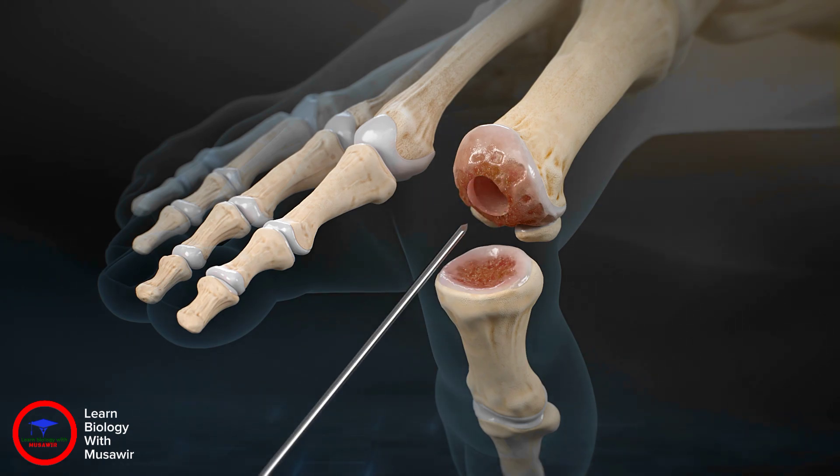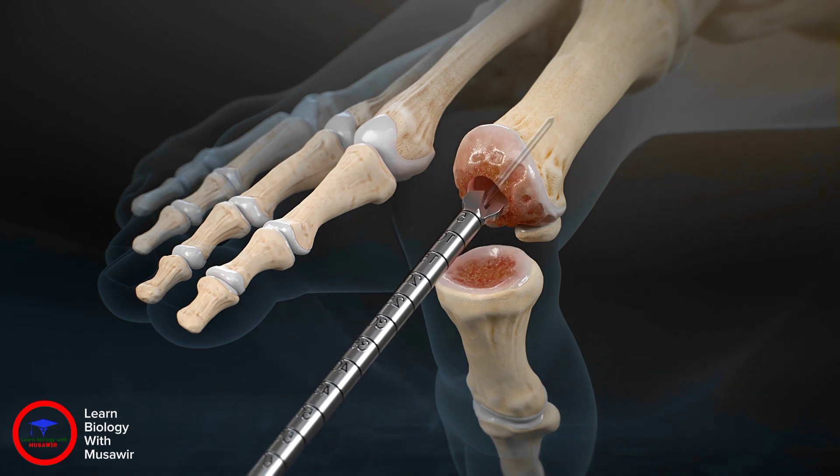The same guide wire is placed centrally into the void left from the removed implant, and the appropriately sized reamer is placed over the guide wire to prepare the metatarsal head for the bone dowel.